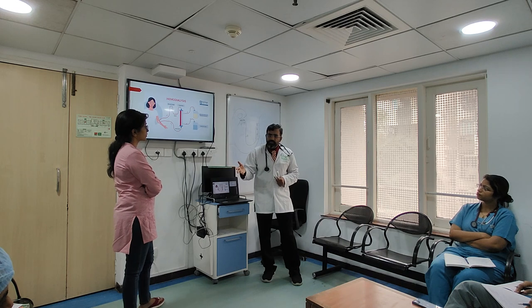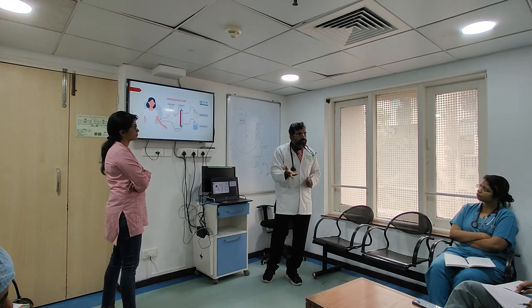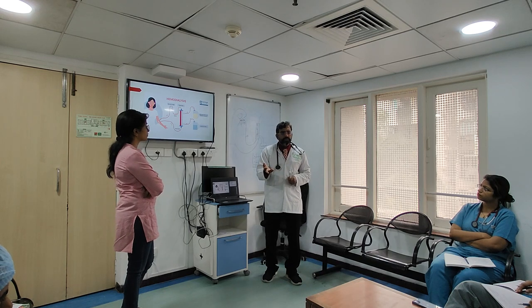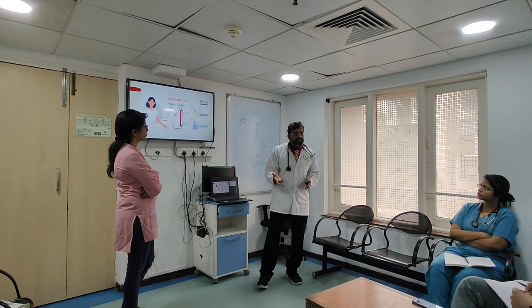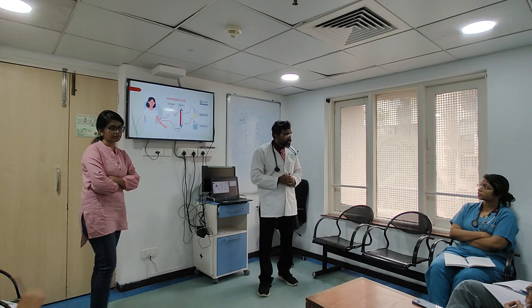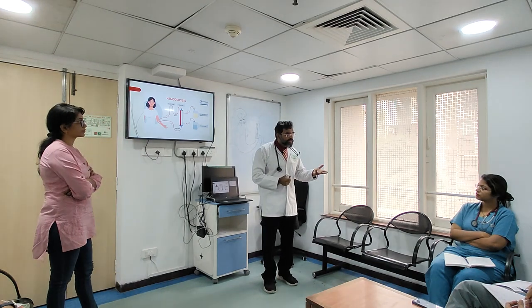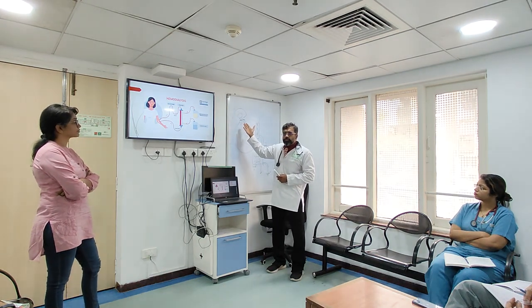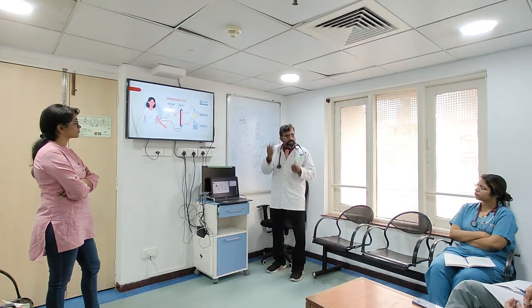Are you understanding? Because if you just change the lumens, what are the problems that will occur? The diameter of the lumens is the same only. But what is going to happen? This entire thing will change, no? The pressure that you are monitoring will change. Artery will become vein, and vein will become artery.